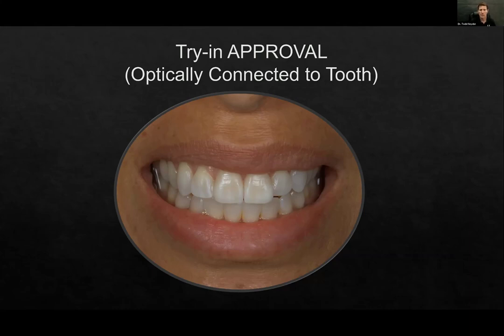Now, I would also say water-soluble because you want it to rinse away quickly and easily. You don't want to have a bunch of cleanup at this point, right? If you want to go back and clean the tooth again with one of those little Kuraray polishers, you can. But since it's water-soluble, usually you just rinse it very well. Just a bunch of rinsing to make sure you've got everything off to completion.